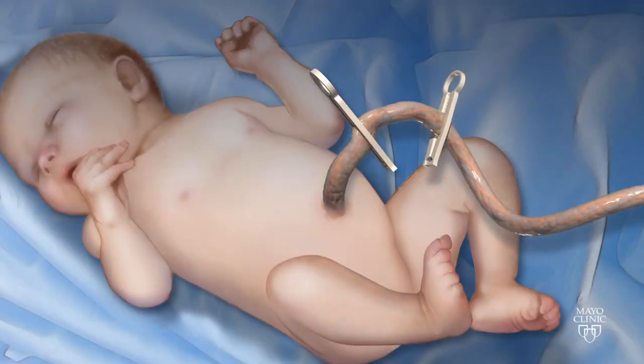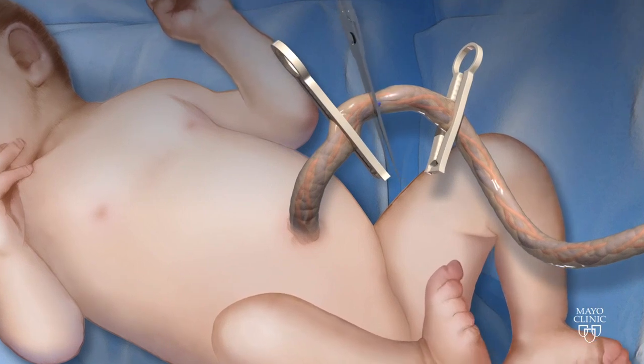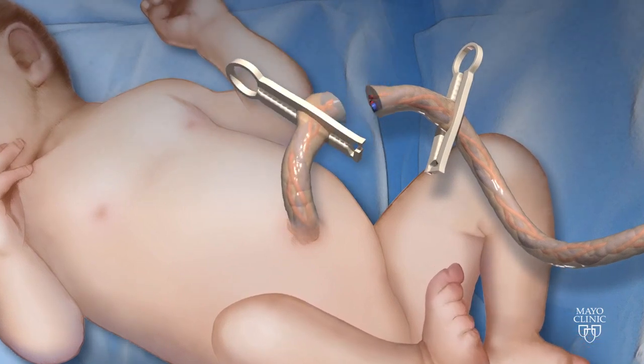As soon as the baby is delivered, double clamp the umbilical cord and cut the cord between the clamps. Approximately 5 to 10 centimeters of cord is typically left at the umbilicus.